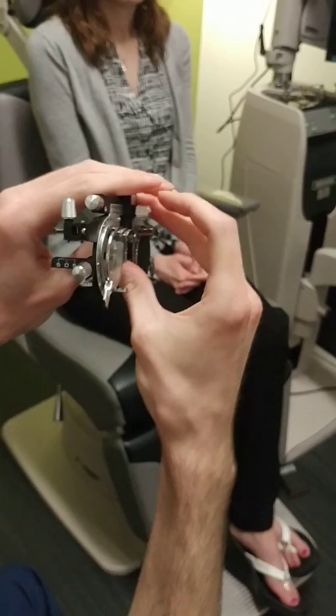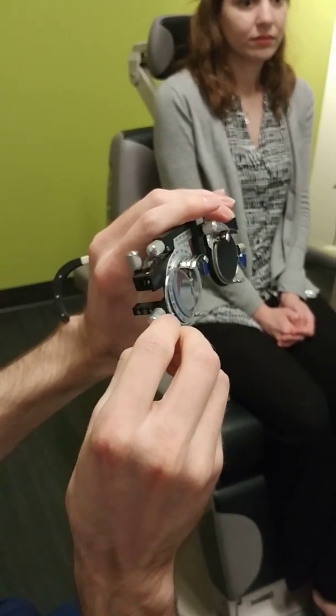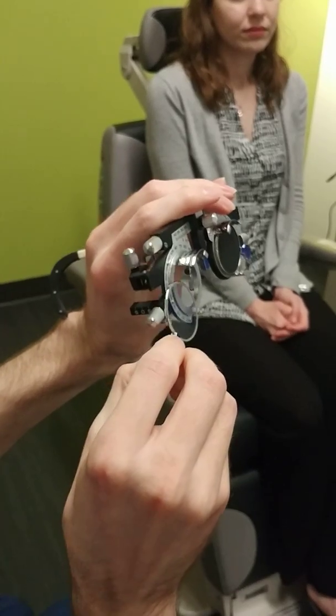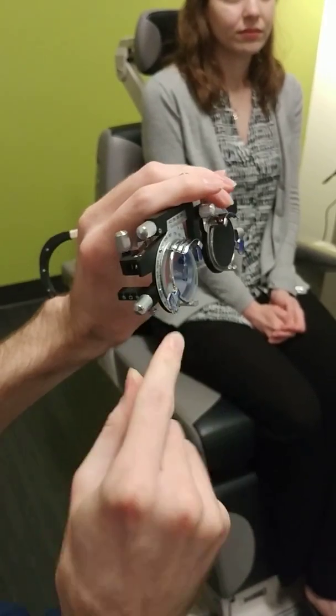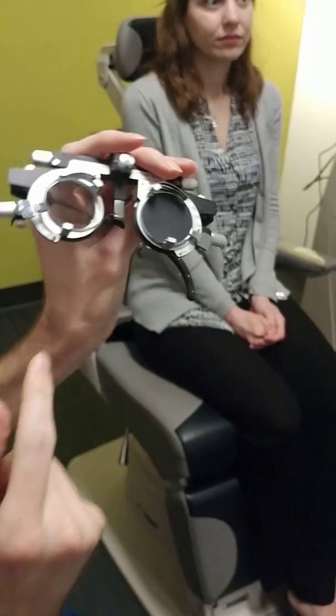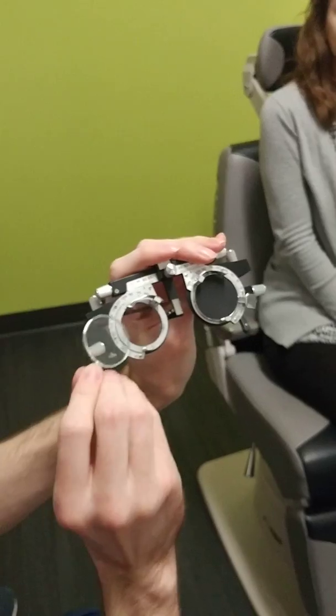A lot of things that I'll see students do: they'll put the lens in but they'll put it in on the wrong track, so it'll be slanted. That actually distorts the amount of astigmatism someone's getting. So make sure the lens is seated correctly on the track.